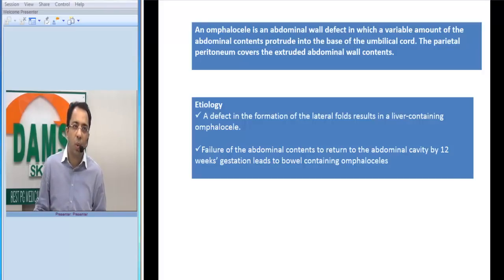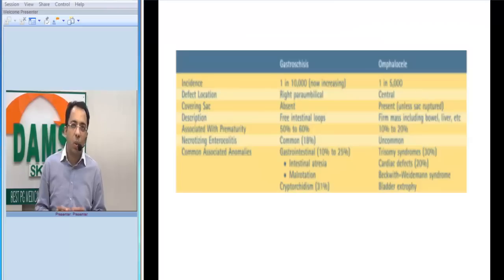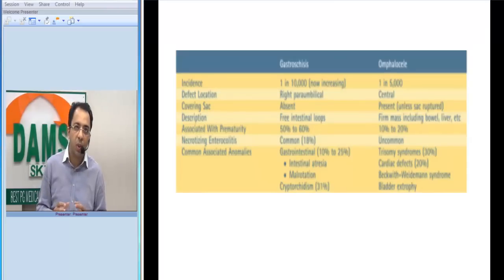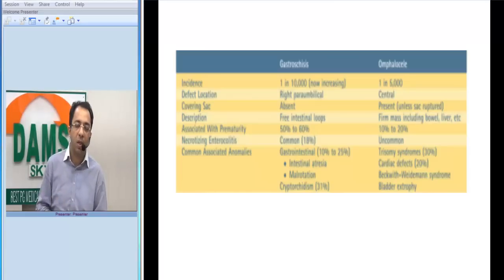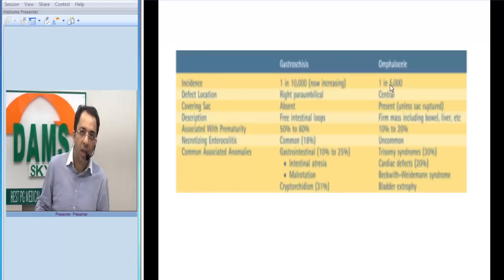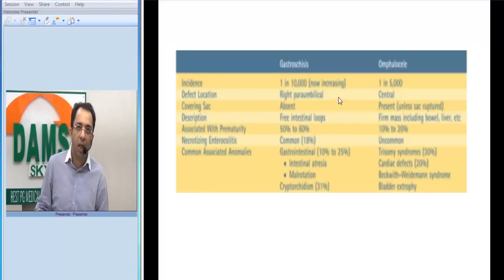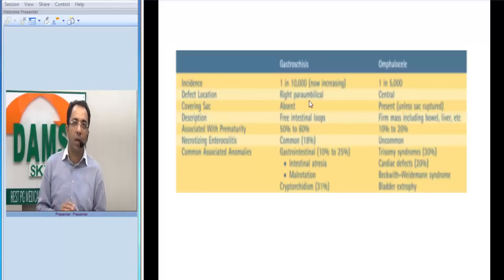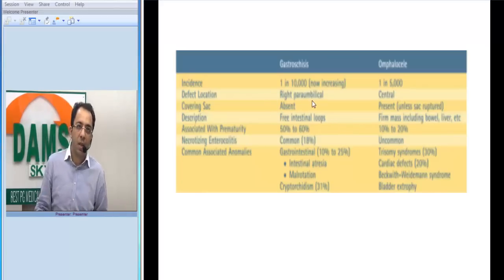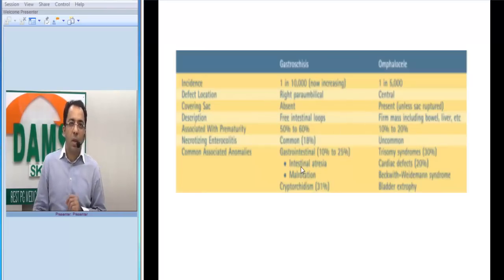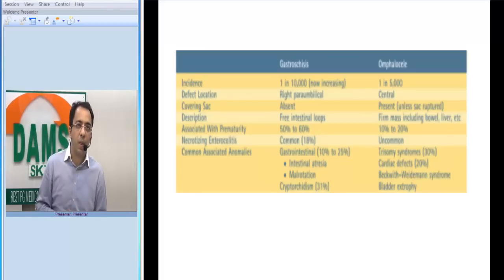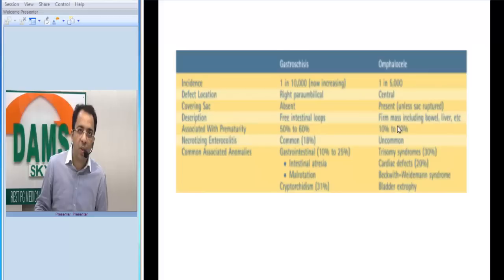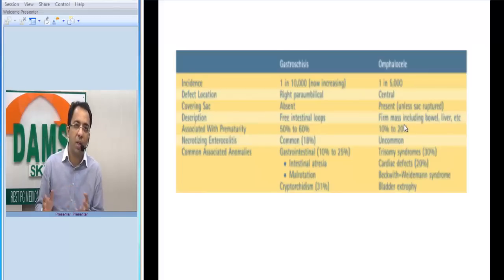A key thing to know as a resident or undergraduate is the difference between gastroschisis and omphalocele. In omphalocele the defect is central; in gastroschisis it is right paraumbilical, or paracentral. In gastroschisis there is no covering sac, while in omphalocele there is a covering sac. Because there is no covering sac in gastroschisis, you will see free-floating intestinal loops in the amniotic cavity, whereas omphalocele presents as a firm mass containing bowel and liver, as seen in this case.